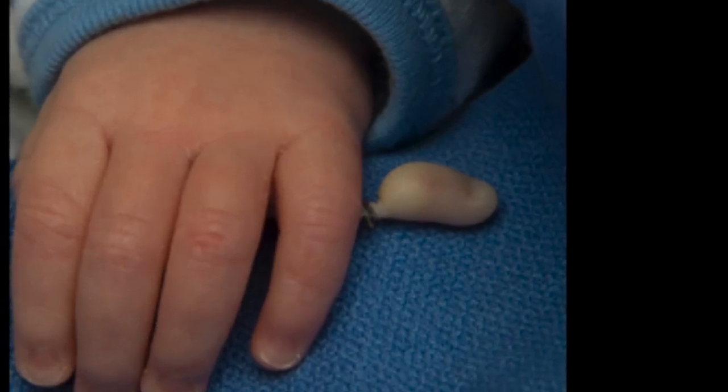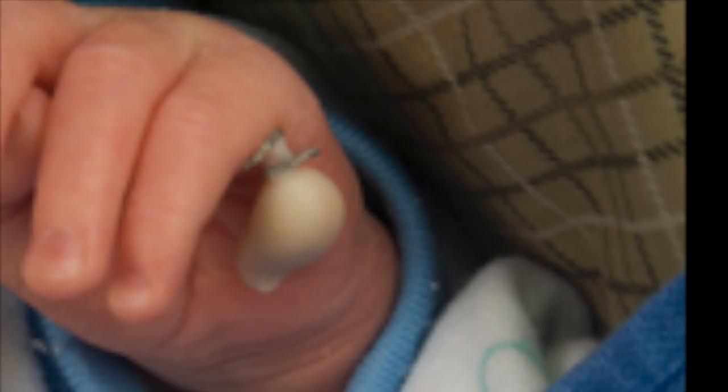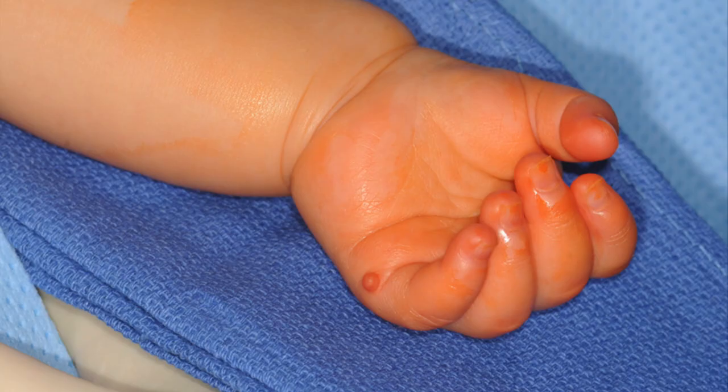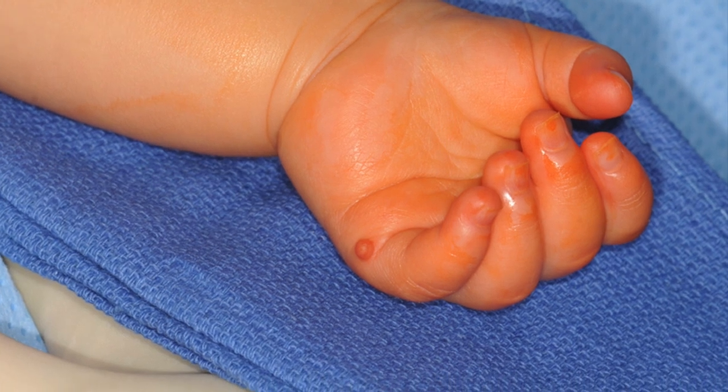Ligature clips have been advocated as an alternative to suture ligation, but we have found the results to be quite similar to suture ligation.